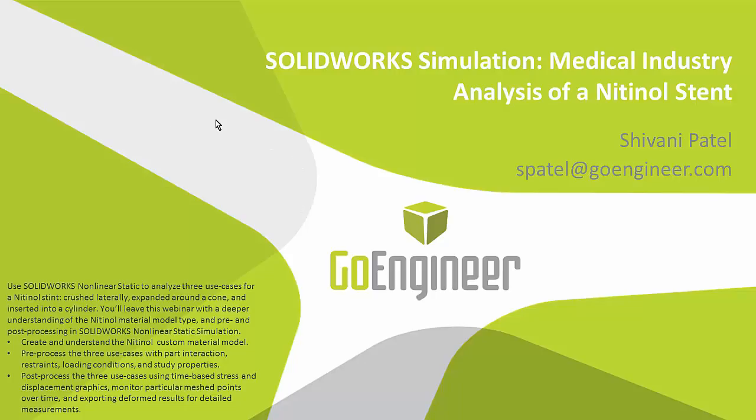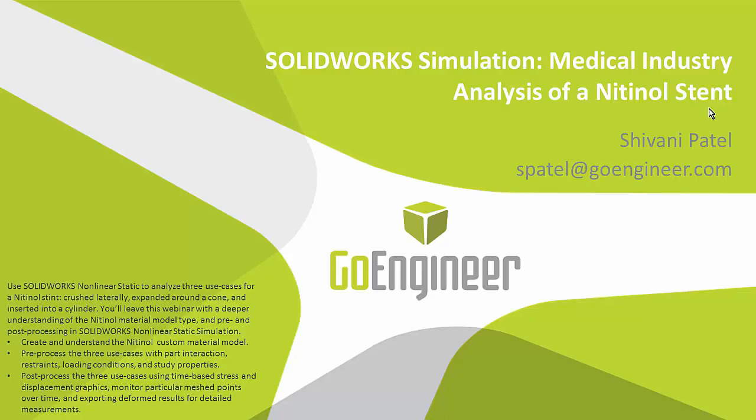In this webinar we're focusing on the nonlinear module obtained from the SOLIDWORKS simulation premium license. The Nitinol material type is only available in nonlinear and the time-based and large displacement analyses I need to analyze the stent is also only available in nonlinear. I want to focus on the nonlinear material model, Nitinol, the three use cases on the Nitinol stent and then three major post-processing options inside of simulation.